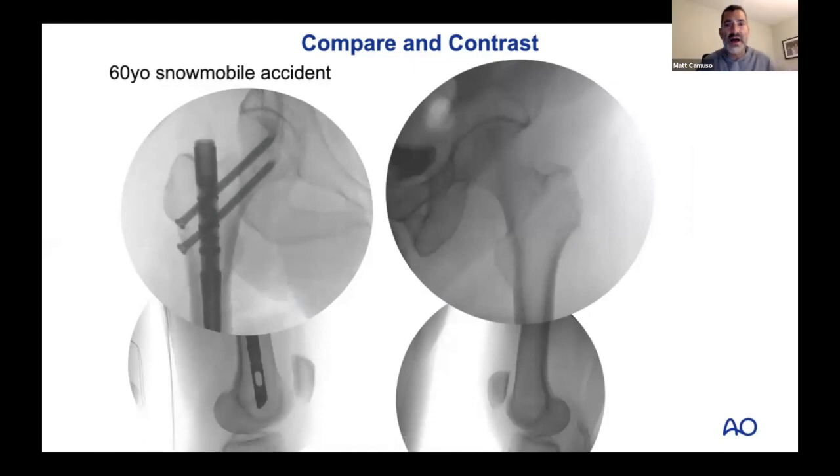You're right. I didn't believe my own eyes, right? I looked at that x-ray and said, these cortical thicknesses on this lady are so perfect, it can't be wrong, because these are my x-rays intra-op. This is my lateral of the uninjured and injured side on that patient in the snowmobile accident. And it's clearly different. Yeah, it is. But I didn't believe it. I was convinced that I was right by looking at the cortical thicknesses, but I wasn't. I didn't even trust my lesser trochanteric view, but I should have. So it's a learning point: you can still screw it up even when you're doing everything right.